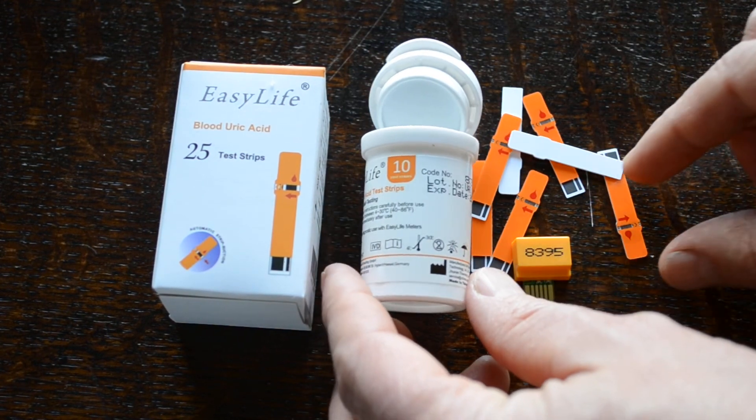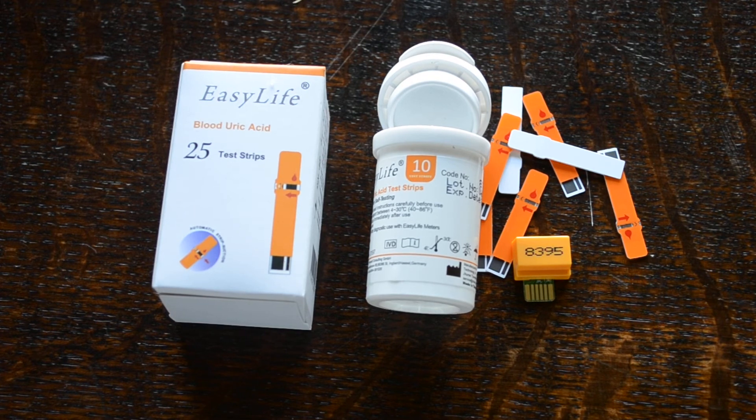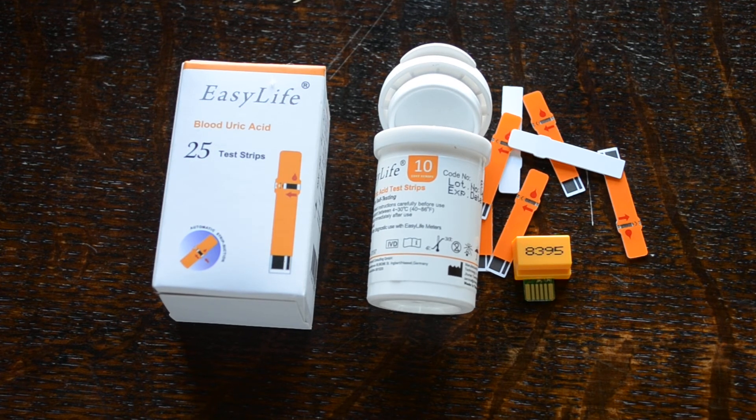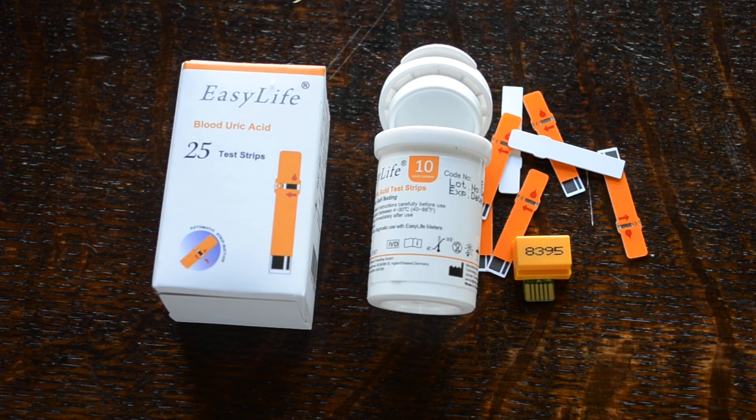The code chip has to be inserted into the meter on the reverse side. When you put the test strip into the meter, you have to check that the corresponding number is displayed on the meter. The code chip is what basically calibrates the meter to know that that batch of test strips are being put through the system, and that will make the test results accurate for those test strips.